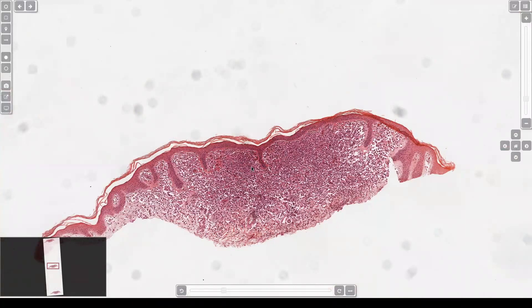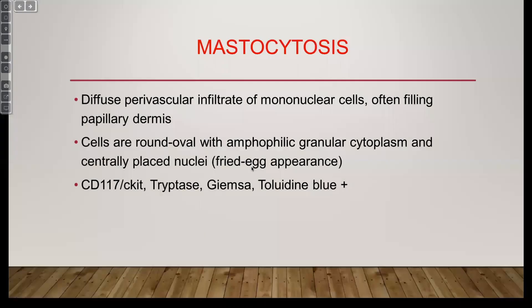This is mastocytosis. Clinically, let them sort out whether it's urticaria pigmentosa or a solitary mastocytoma — when the infiltrate is really cellular like this it usually means a younger patient. I just diagnose mastocytosis and let the clinical picture sort it out. If cells are involved in the epidermis, think of Langerhans cell histiocytosis — at high power, Langerhans cells look quite different from mastocytosis.